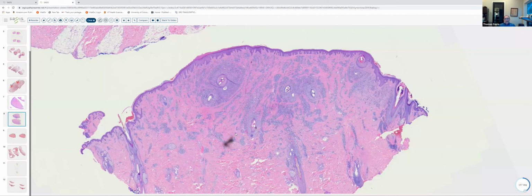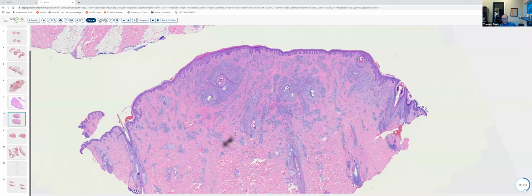And most chronic recurrent suppurative folliculitides are characterized by fibrosis and will frequently be accompanied by a heavy lymphoplasmacytic infiltrate. And in actuality, this is very difficult to distinguish from folliculitis decalvans or from just a chronic deep-seated suppurative folliculitis, for instance, such as you'd see in acne conglobata or even in hidradenitis. Although in those instances, you will usually see ultimate development of a sinus tract, which you don't see here.